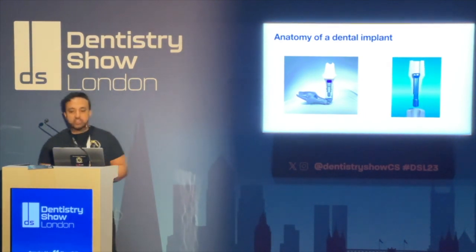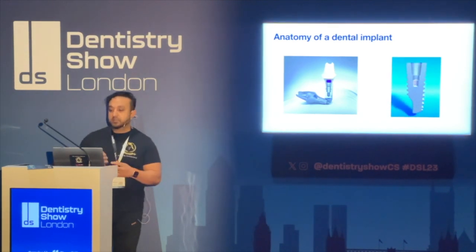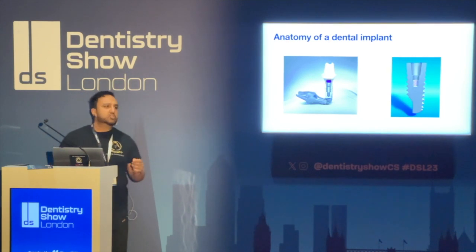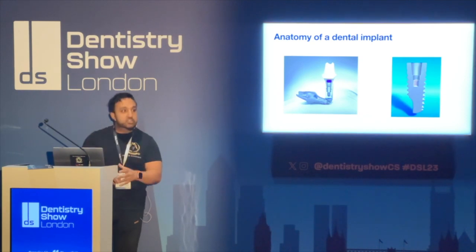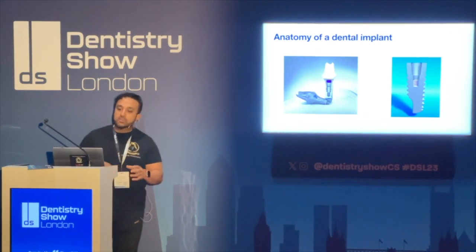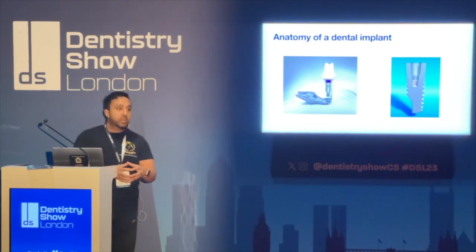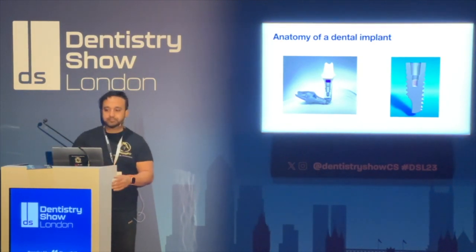So here we have an animation of an abutment. This is effectively like when you do a post crown, and it's like the post that goes into the implant. And the connection that we're seeing here is called a Morse taper connection. This is the most common type of connection of the abutment, or post that holds the crown, into the implant itself. And that's held by a screw, and that screw has a certain torque value to go in. So the really important thing is to understand that you have this screw, which is effectively the root of the tooth, and you have the post, which is the abutment that goes into the actual connection of the implant.